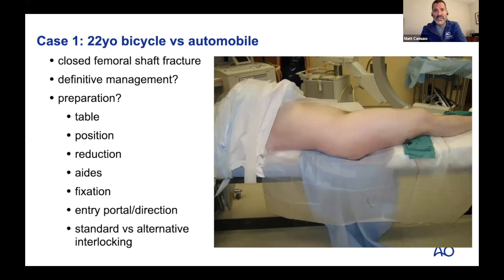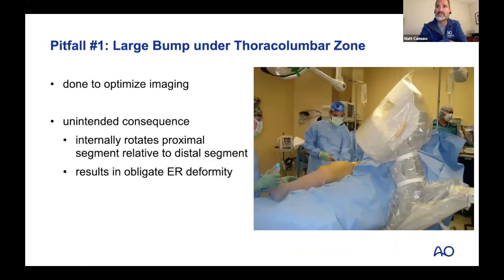I have someone that stands at the end of the bed and can drive the leg around, but many people will actually also put in a traction pin and put sterile rope off the end of the bed and hang a little bit of traction that will function as a sort of fracture table, but also gives you the advantage of having the ability to remove it and adjust the position of the leg and then reapply it once again.